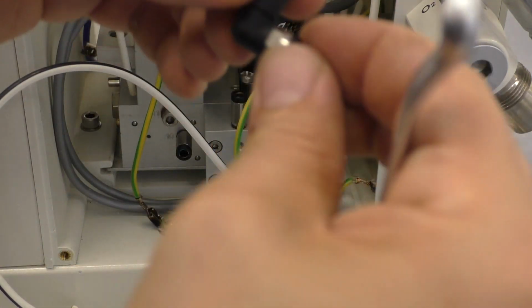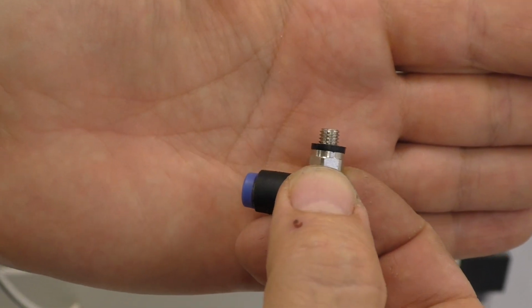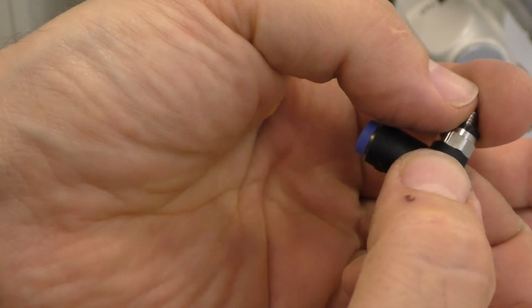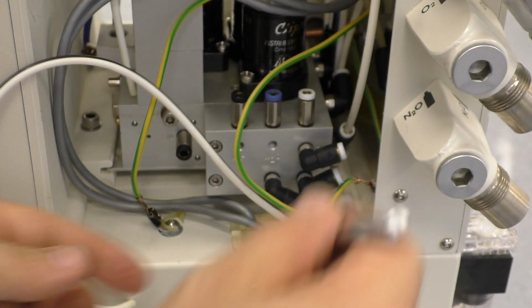Oops, I'm off the camera. You can screw that part. Focus, you! Oh, it helps. My camera has that feature too. Okay, so you can turn that. You just screw it in and then you set it into the direction you want. And you plug in the hose and everything is fine.